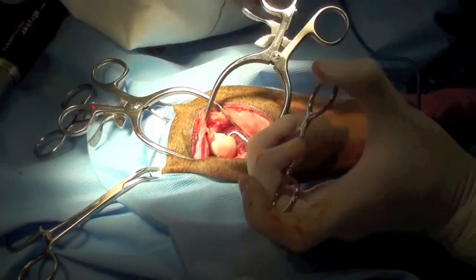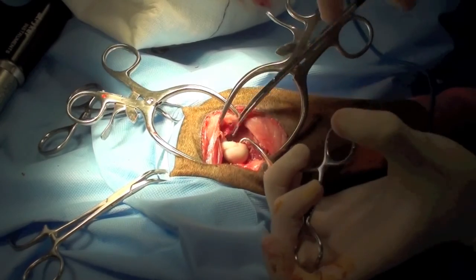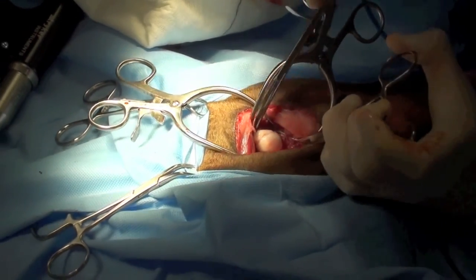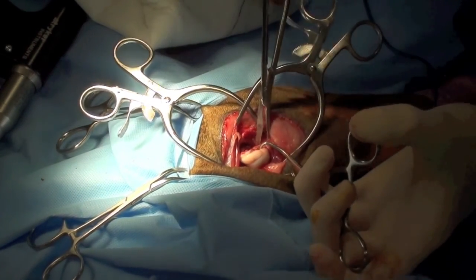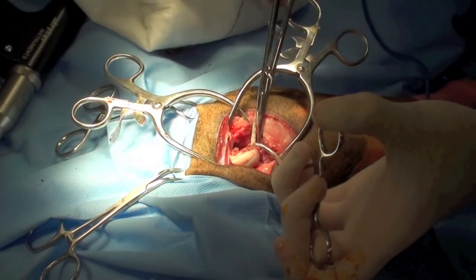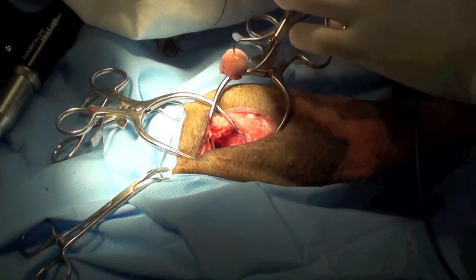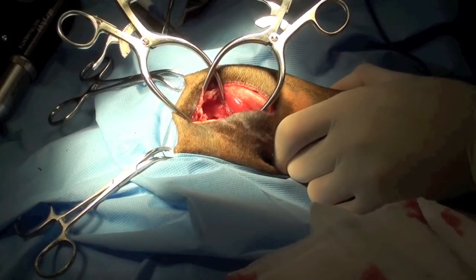Soft tissue attachments to the femoral neck are sharply incised. The femoral head is examined closely to make sure that no articular cartilage remains.